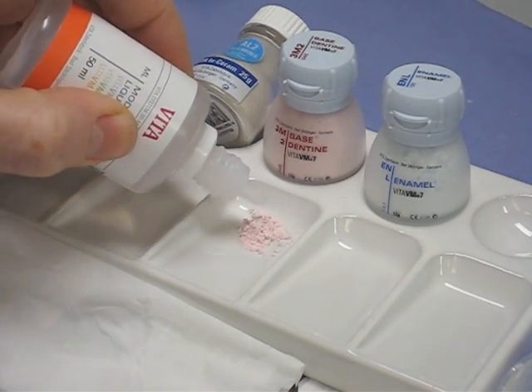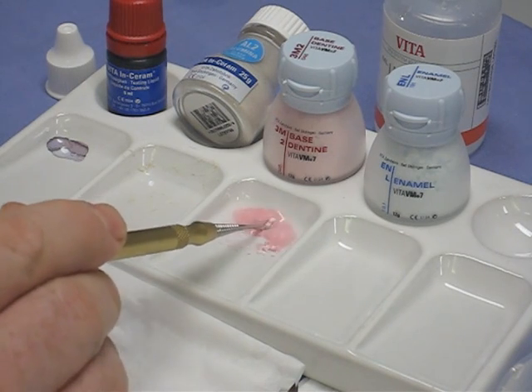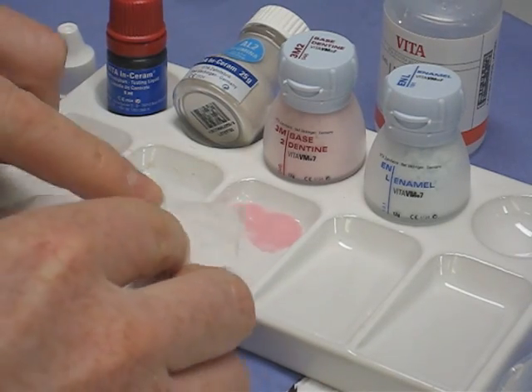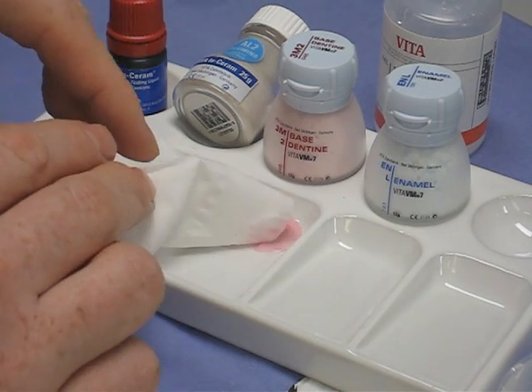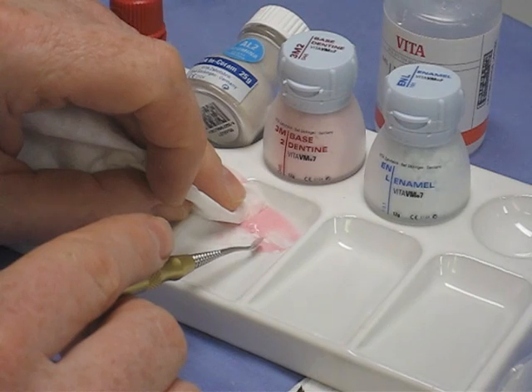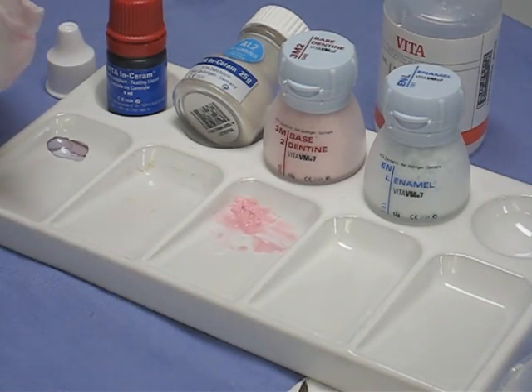The base dentine is mixed with a small amount of modeling fluid. When mixing ceramics in the palette we use a special instrument — not any standard lacron — because we don't want to get metals into the material which would discolour it on firing. We either use a glass rod or one of these special ceramic instruments. Because there's a bit too much liquid, we blot some of the excess out. We don't just keep adding more powder — these materials are ridiculously expensive — so we blot the excess and aim for the consistency of wet sand, just like building a sandcastle: not too wet or it slumps, not too dry or it falls apart.